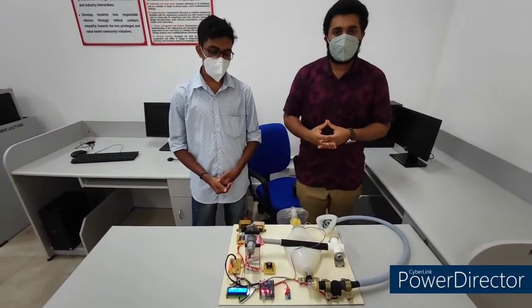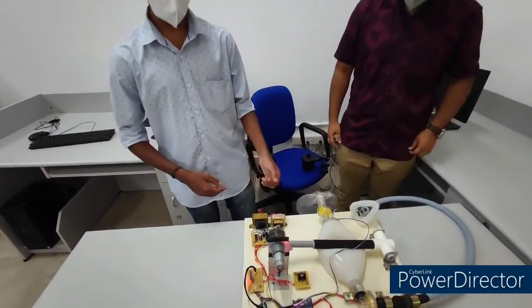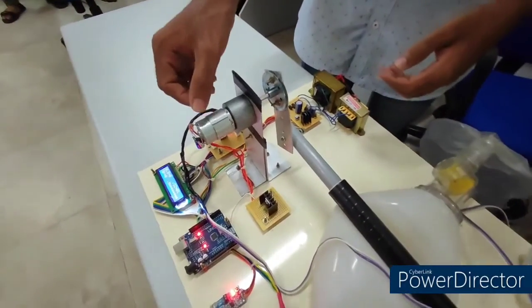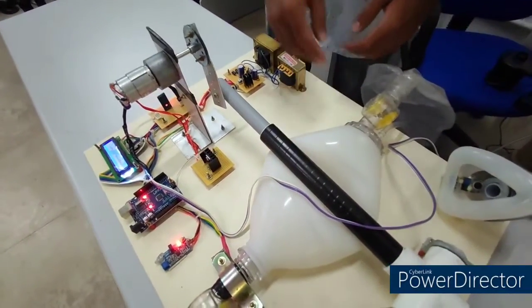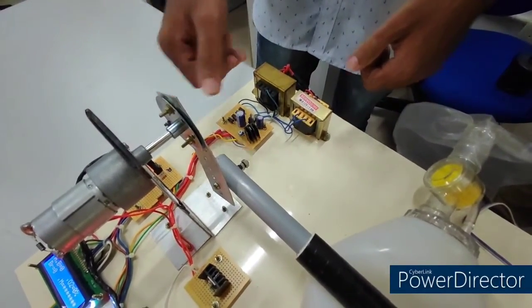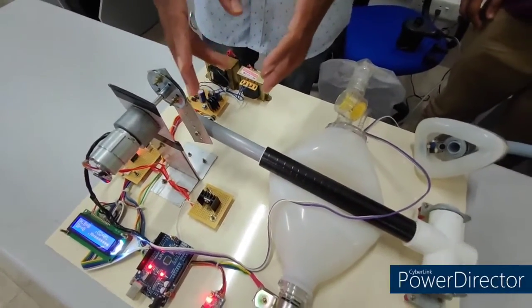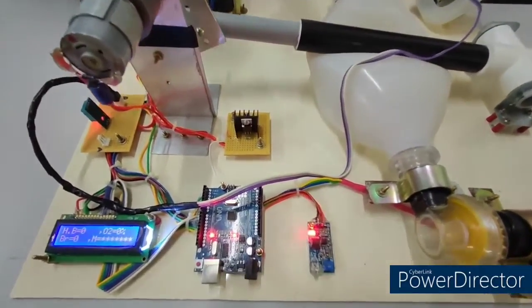Coming to the mechanical working — as mentioned, it is a mechanical ventilator. Therefore we need a compression mechanism, so we use a DC 12-volt motor for that. The 12-volt motor compresses the Ambu bag. We have two power supplies: one 12-volt for the motor, and one 5-volt for the Arduino, LCD, pulse oximeter sensor, and temperature sensor. The motor is driven by a motor driver, and coding and control are done by the Arduino Uno. Using the pulse oximeter, we can read heartbeat values.